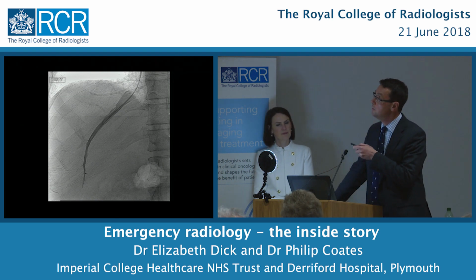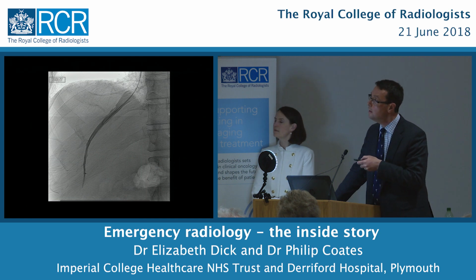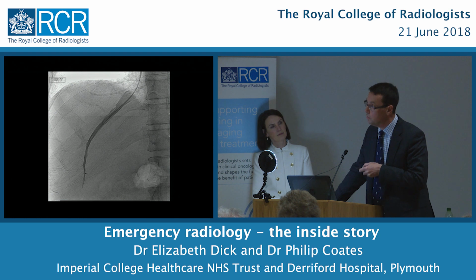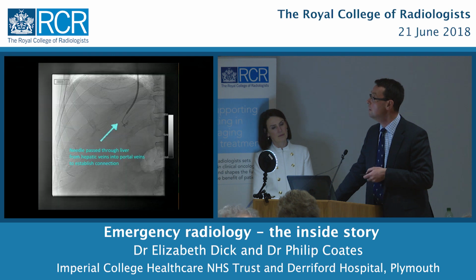The first thing she's done is the heart is up here at the top of the screen. Her catheter has come down into the right hepatic vein. We go on the right side because there's more liver to work in around here. And she's going to have to make a hole between the hepatic vein and the portal vein to create this pathway. There's the catheter. Catheter's lodged at the bottom.